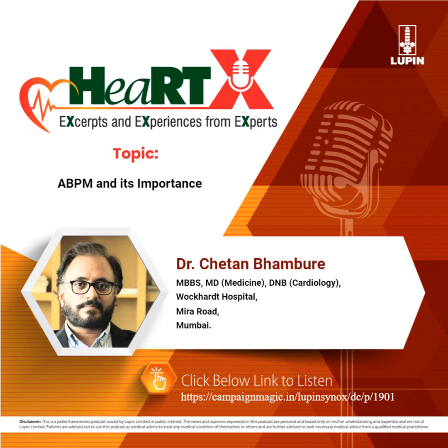It's a better predictor of hypertension-mediated organ damage than office BP. 24-hour ABPM mean has been consistently shown to have a closer relationship with morbid or fatal events. It is more sensitive than office BP for CV outcomes such as coronary morbidity or fatal events and stroke. It can identify accurately white coat and masked hypertension. There is stronger prognostic evidence.